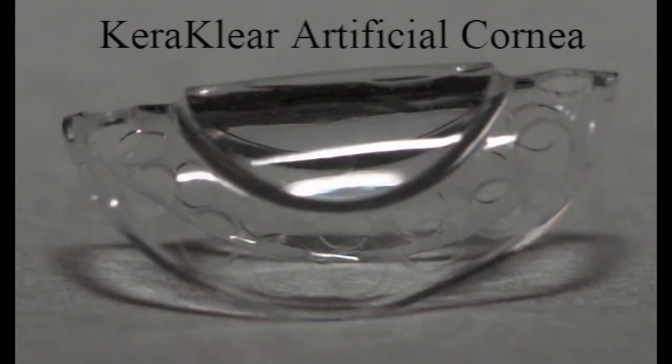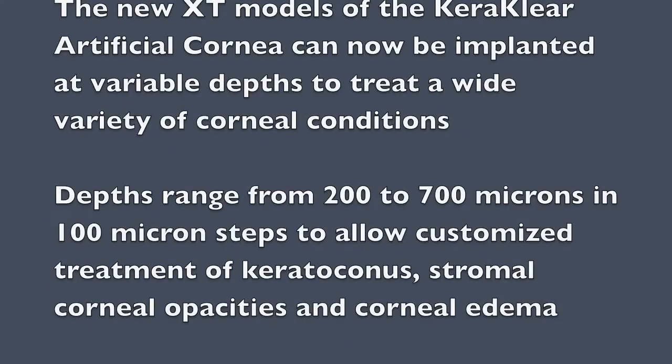The KeraKlear artificial cornea is the only minimally invasive foldable artificial cornea designed to be placed into a non-penetrating corneal pocket. Placement of the KeraKlear only requires removal of approximately 5% of the recipient corneal tissue. The new XT models of the KeraKlear artificial cornea can now be implanted at variable depths to treat a wide variety of corneal conditions.